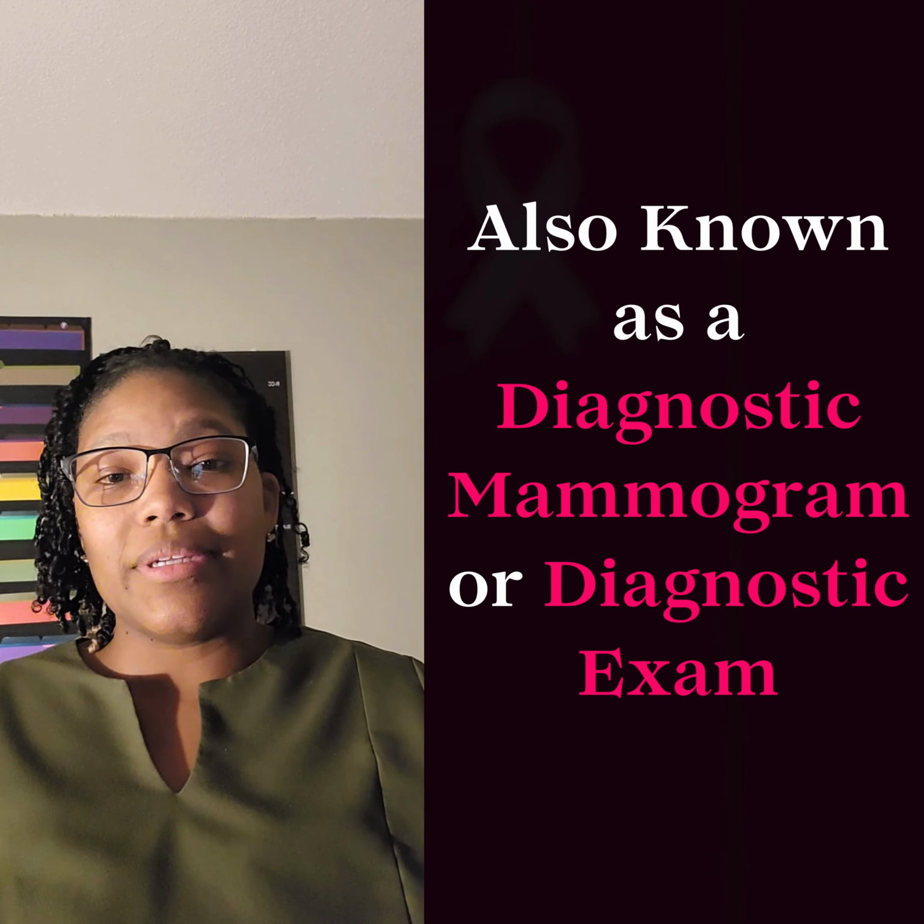Or it could be that there was something seen in your breast that was on one side and not the other, or vice versa, or both breasts. And that area needs additional imaging, meaning it needs more focal imaging done. Once you go in for your additional imaging, your next result could be a BI-RADS 3, BI-RADS 4, BI-RADS 5, or BI-RADS 6, and I will explain those.